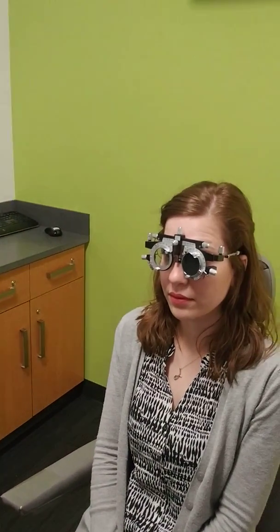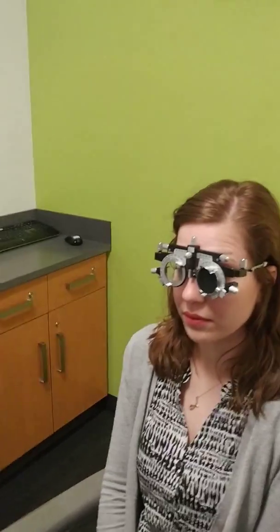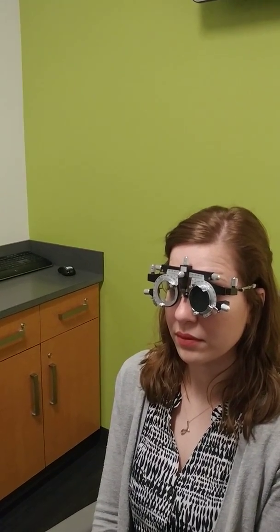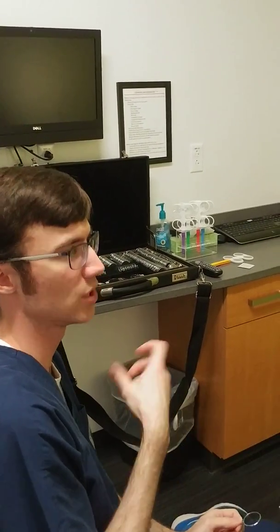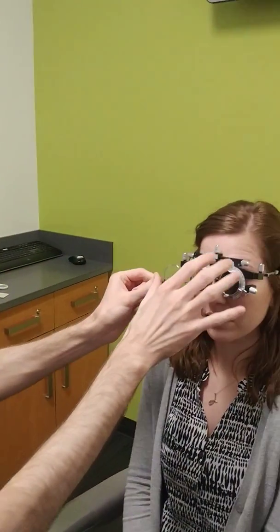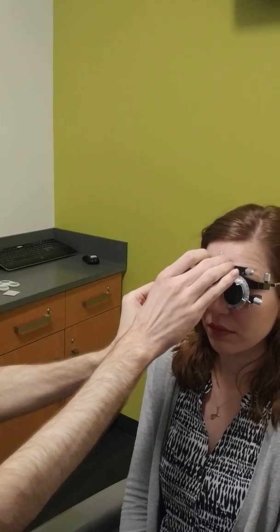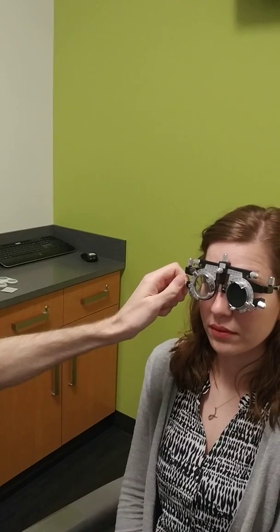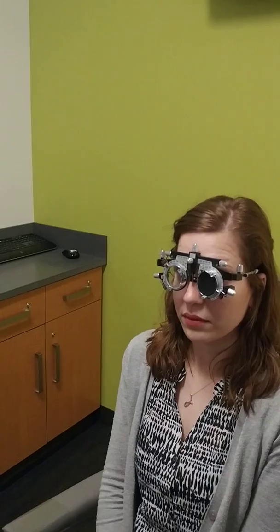The trial frame is basically just like a phoropter — it's the old version of a phoropter. Just like you would dial in if you started without any astigmatism correction, you would dial in a 0.50 to check if the patient had cylinder. I'm going to put a 0.50 lens in the well here and make it axis 90 — you can see the little mark at 90.